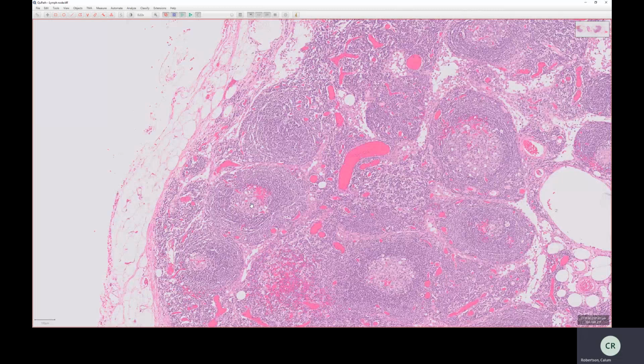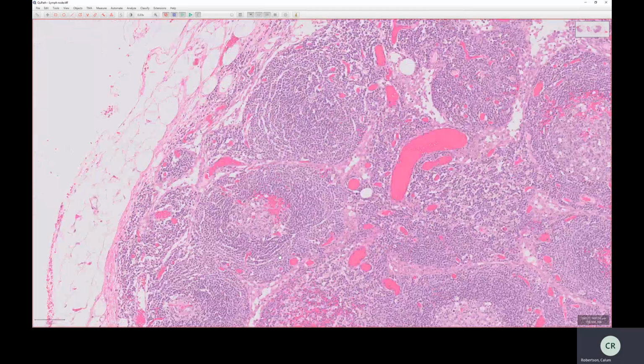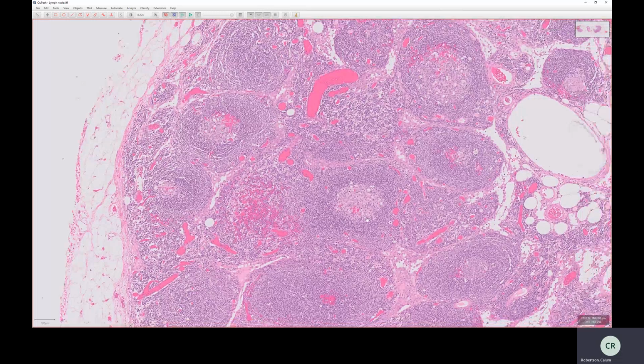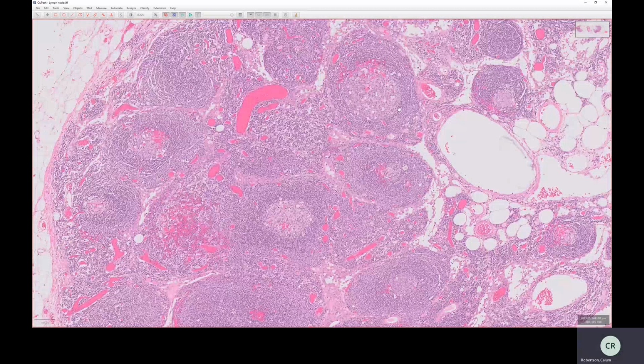but in the center of it, there is what we call a germinal center, which looks quite different from the inactivated cells around it. Cells within the germinal center are activated, they're replicating, and we're going to go into that in a second. But you can see, I think it's quite obvious. Here's a germinal center, here's another, and another, here's one, here's a big one.